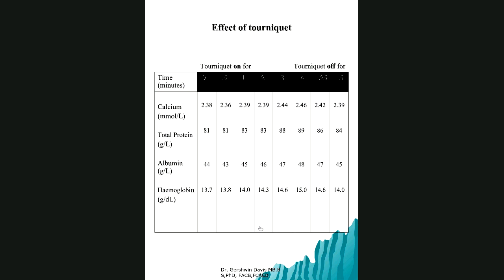Okay, so you see what's happening here. When the tourniquet is off, what happens? It actually comes down. Let me just read the chat.